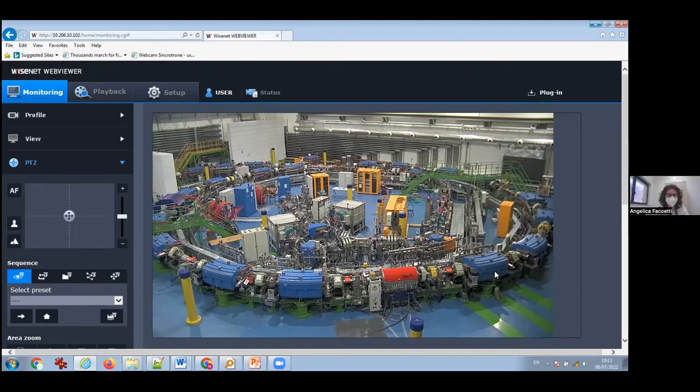Nicholas: What are those red spools exactly, Marco? Do they have to be so long, or is it because you connect? These are the pulse forming network. Yes, they have to be a given length because the electric signal sent to the fast magnets, to the tune kicker, has to go to the end of the cable and rebound back in order to make a square pulse of the duration that you want.